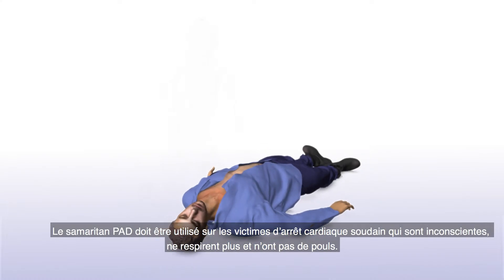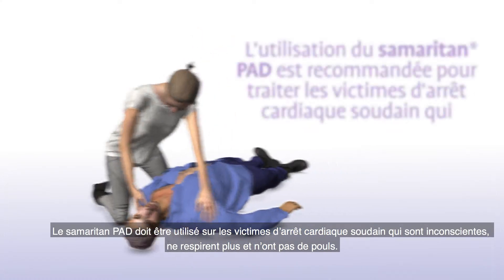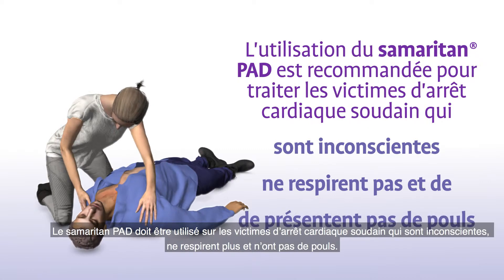The Samaritan PAD should be used on victims of sudden cardiac arrest who are unconscious, not breathing and have no pulse.